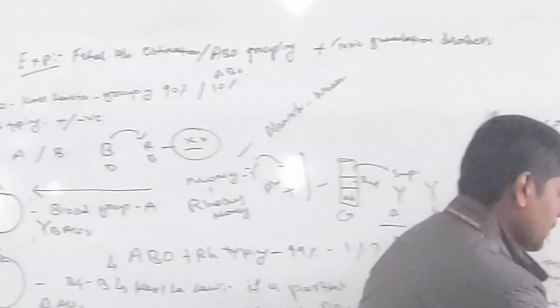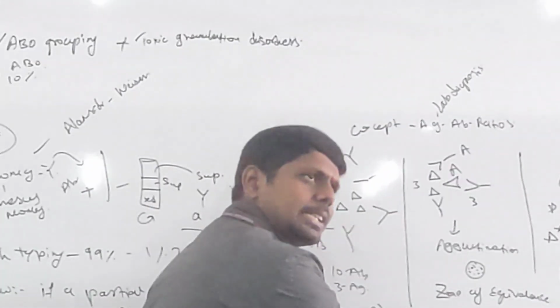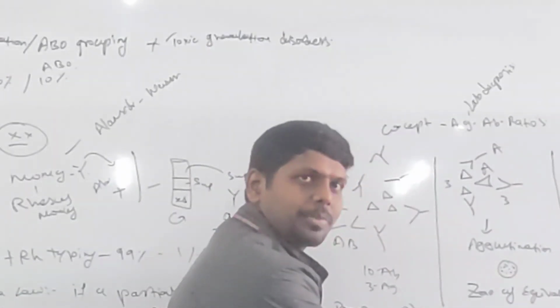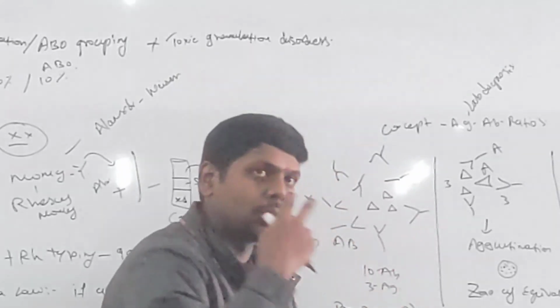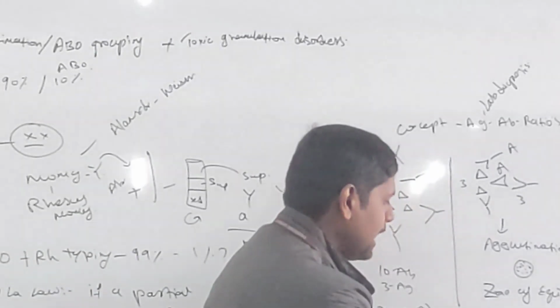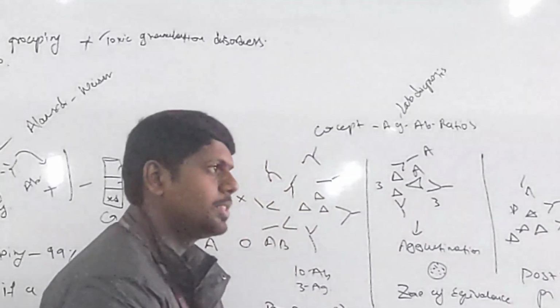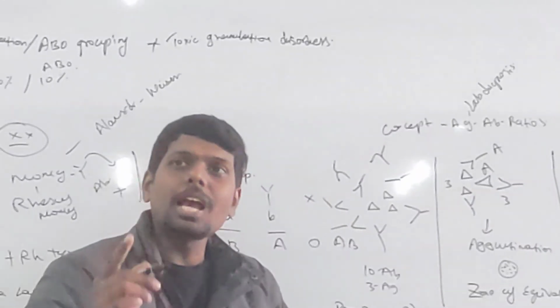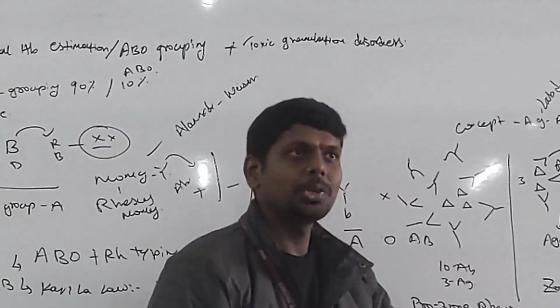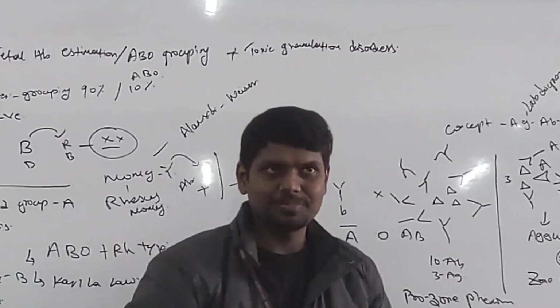Okay, see, if I keep blood first, I kept 3 drops of blood. Then I added my anti-seras. When I am adding anti-seras, sometimes students might touch the blood drop due to eyesight issues. If that happens, my A antibody reagent might contaminate this. There is a chance of cross-contamination of antibodies due to the blood first approach. That is why the right approach will be anti-sera first.